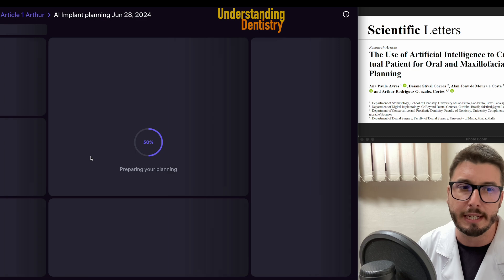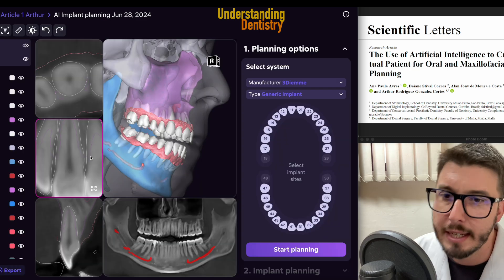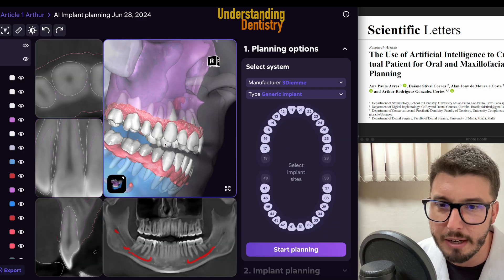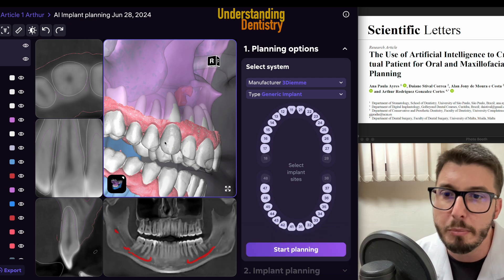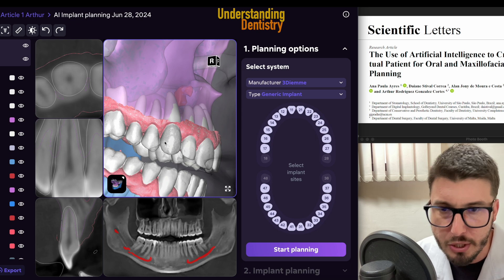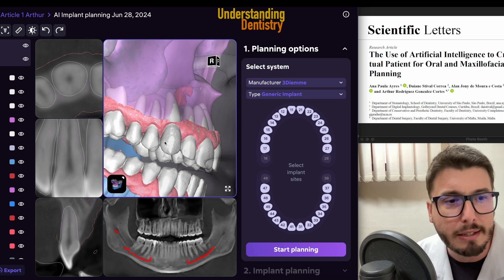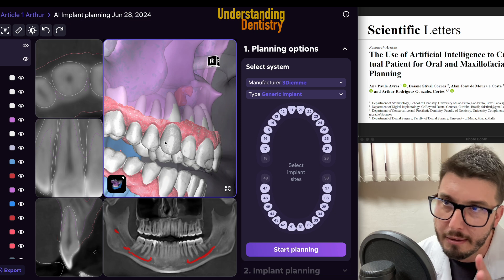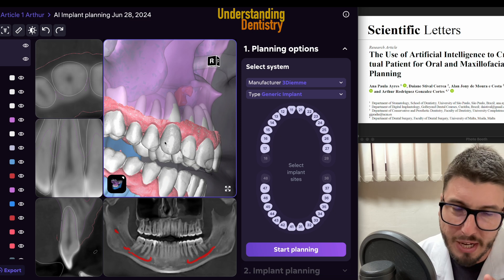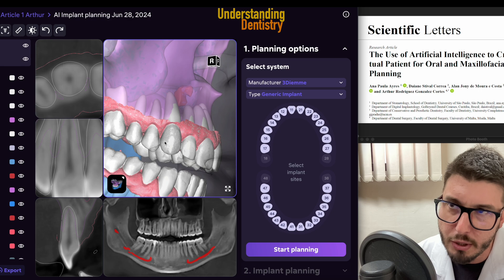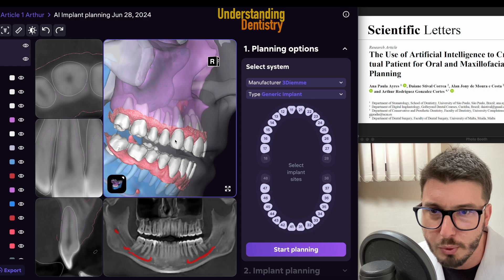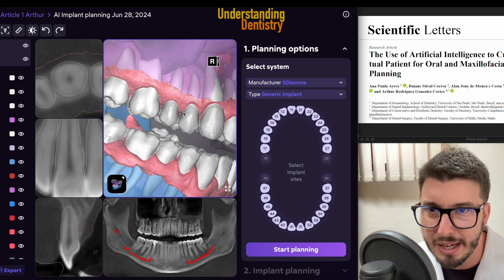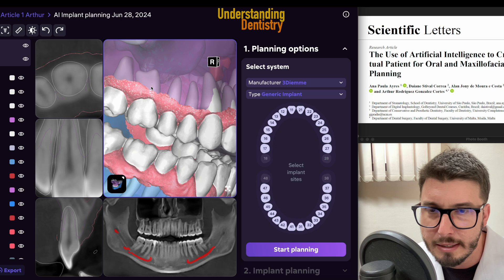Now the implant planning. Let's see an implant planning. We now have the intraoral scans — you upload both intraoral scans, upper and lower, not the bite registration, along with the CBCT. You need to upload the three files at the same time for the implant planning algorithm of DiagnocCat. Then basically you have the virtual patient for dental implants, which is a little more complex because now we have even the soft tissue and the bone tissue.